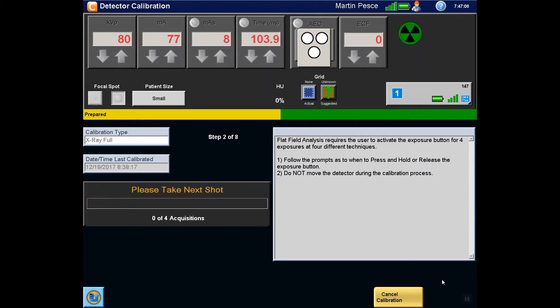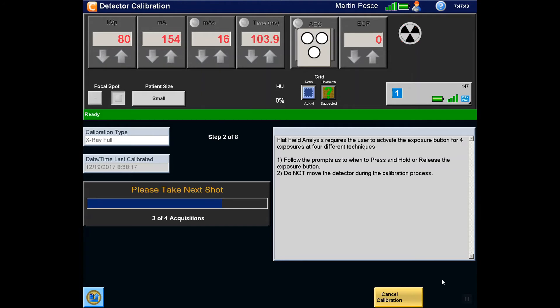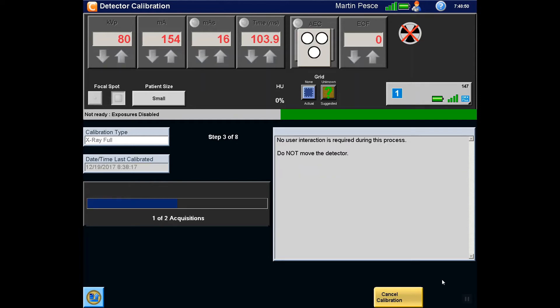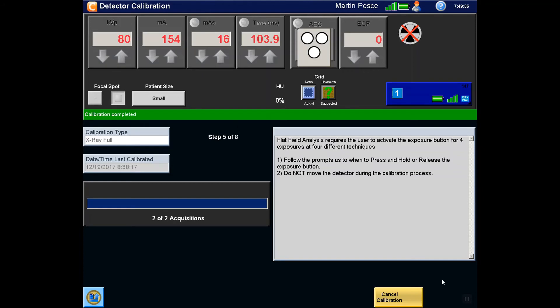Here too, we will advance to Step 3 to save some time. Step 3 is an automated process and will require no interaction by the radiographer. Step 4 is also an automated process.